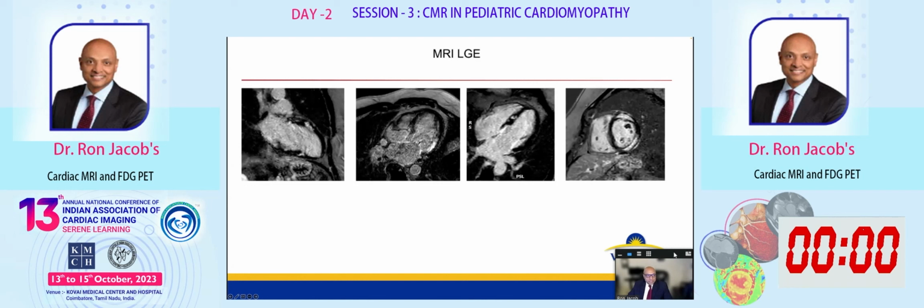So this was the patient's LGE, and it's really important to integrate everything: wall motion, your STIRs, your maps, and then look at LGE. And so you have this typical epicardial enhancement in the basal anterior wall, and I don't have the basal anteroseptal slice here, but the basal anteroseptal slice also had involvement, and the basal inferolateral segment had patchy involvement. This could be either myocarditis or suggests an inflammatory process with the T1, T2 markers.